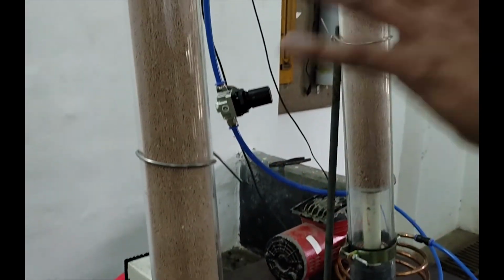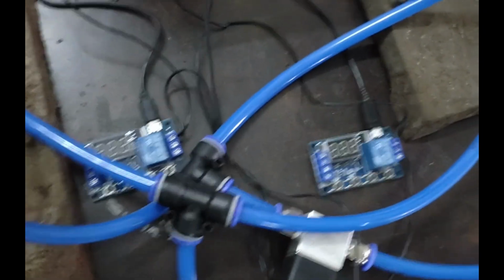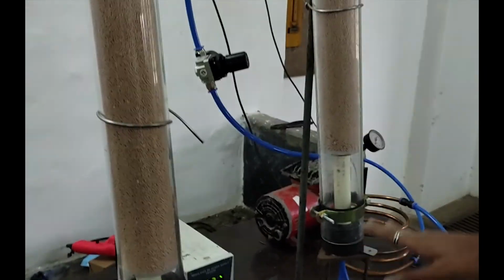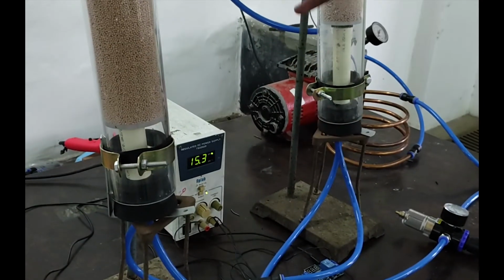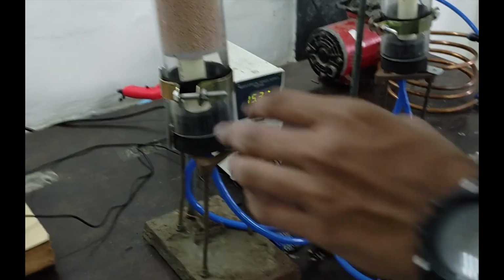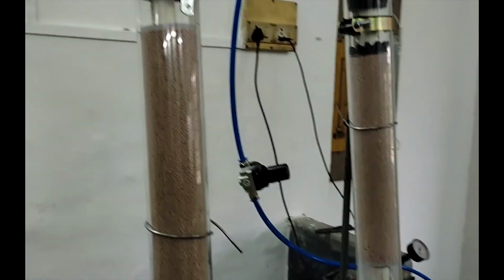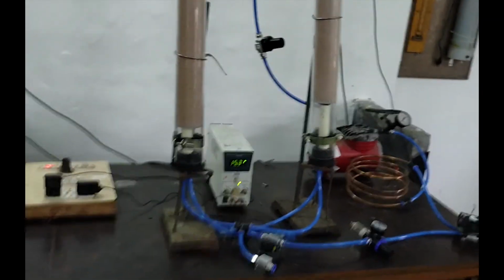And this is how our actual setup looks. We are controlling all the electronic system using the delay trigger relay, which is synchronized between each other. At the inlet side we have turned on the solenoid valve for 1 minute, and at the exhaust side we have turned on the solenoid valve for 30 seconds. So this is how our actual setup looks. You can see the whole setup.